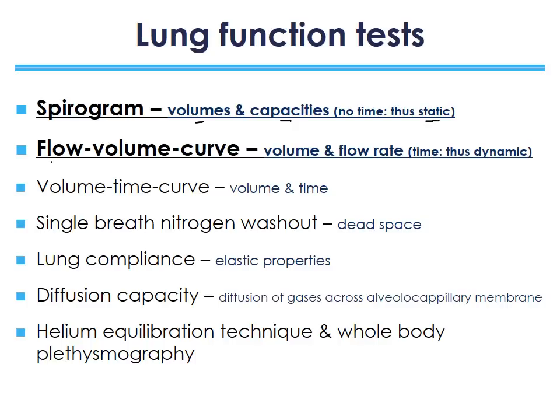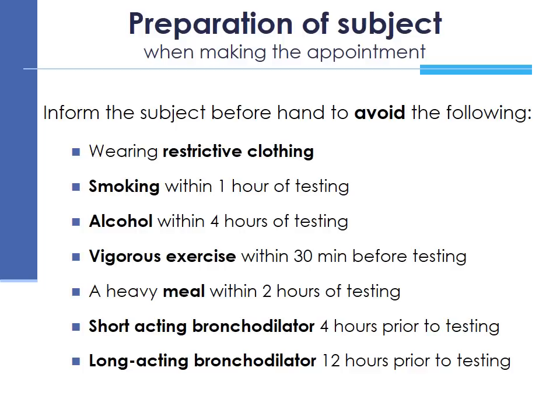However, the flow volume curve measures volume and flow rate. Flow rate refers to the speed of the flow of air. So this tells us that time is involved in these measurements, and therefore measurements taken by the flow volume curve are considered to be dynamic. Okay, so let's start off from the very start.